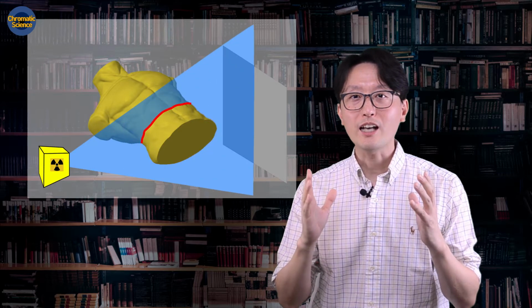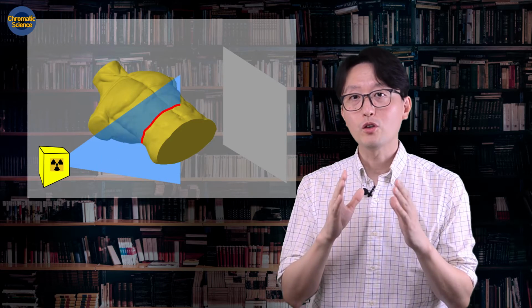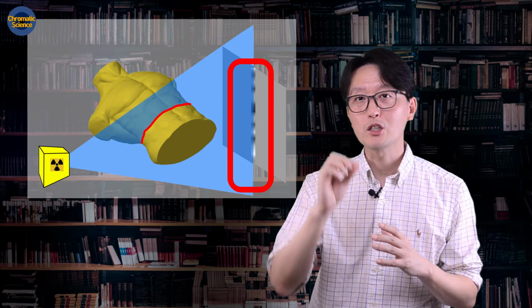So the X-ray image is not two-dimensional. It is just a one-dimensional image. If you look at the details of this one-dimensional image of X-ray, depending on the location, you will see different X-ray intensities. Let's call it X-ray projection. When the X-ray penetrates the body, the intensity of the X-ray will be reduced. The X-ray intensity will be reduced much if it penetrates bones, but if the X-ray penetrates fat or muscles, then it will not be reduced as much.